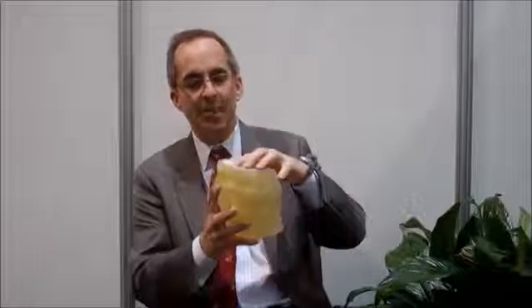One of the novel things that we've done with that Stratasys PolyJet printer technology is we've also been able to print the 3D soft tissue models. And those soft tissue models are unique in so much as they show us not just the bone, but a conglomerate of all of the soft tissues of the face that you can see match with the bony structures. And so we can now appreciate not just one tissue type, the bone, but the soft tissues around the face.